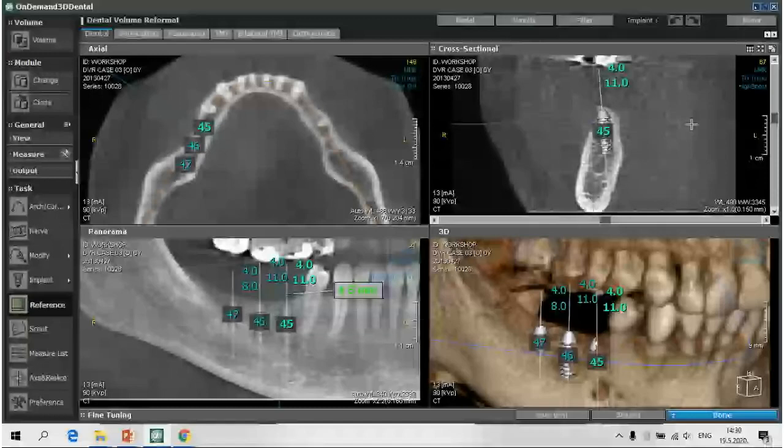So we as practitioners should be able to understand the procedure and to do it, or to check it by ourselves, and to be comfortable deciding whether the technician did a good job or not.